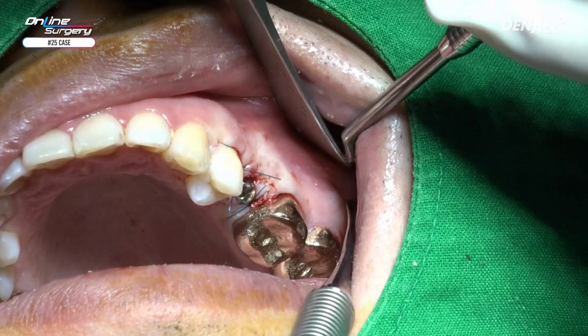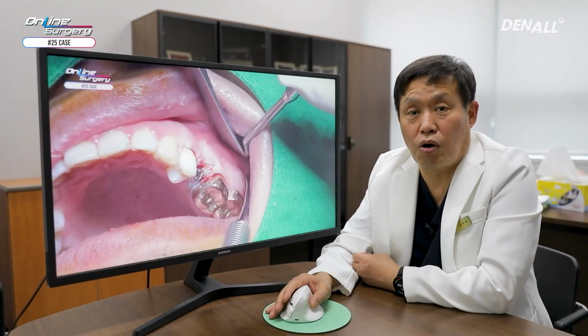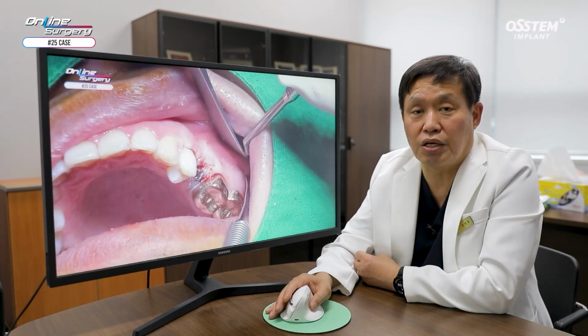In this case, as shown, there was an alveolar bone defect on the buccal side. A Oss was used for intra-socket graft. Intra-socket graft was planned, however, a tissue punch was used to remove overriding mucosa because the patient had extraction 5 months ago, and after placing the implant, a minor flap was reflected to perform the intra-socket graft.